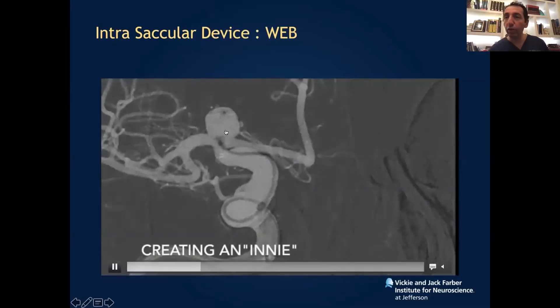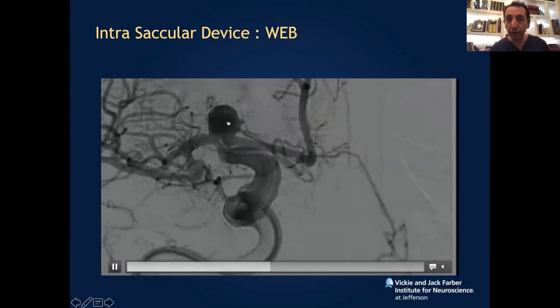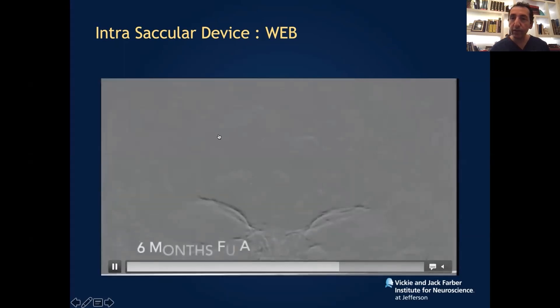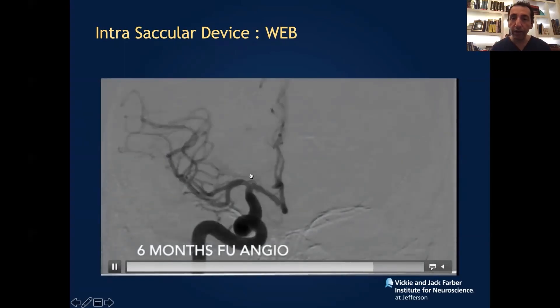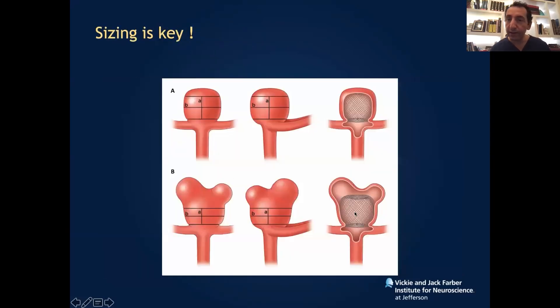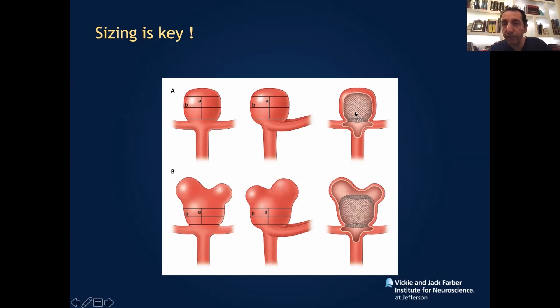The WEB device is like a little cage. This is an ICA bifurcation aneurysm — we deploy the WEB device here. This is a six-month follow-up angiogram showing that it's completely gone. Unlike coils, where you go one after the other, with the WEB device you just go in and deploy it — it takes five minutes and you're done. The WEB device was FDA approved a couple of years ago.